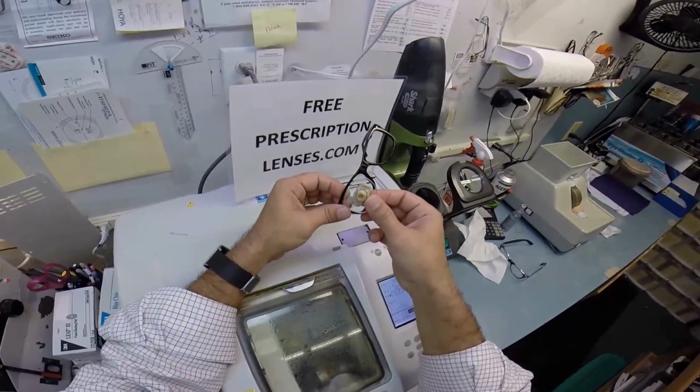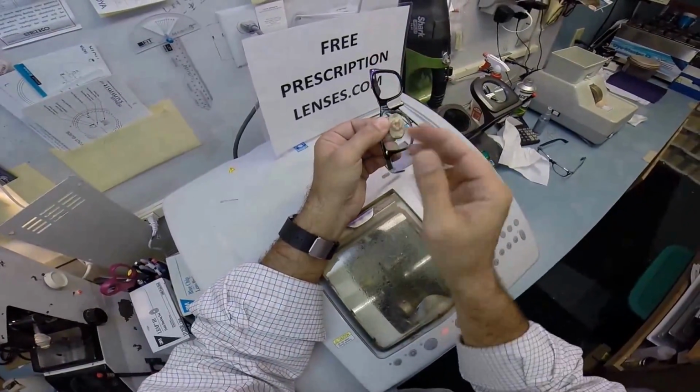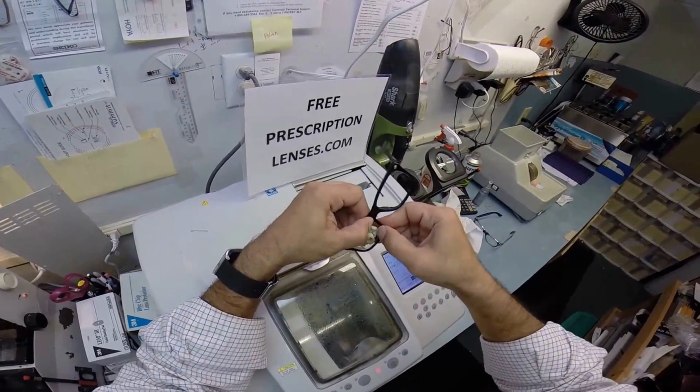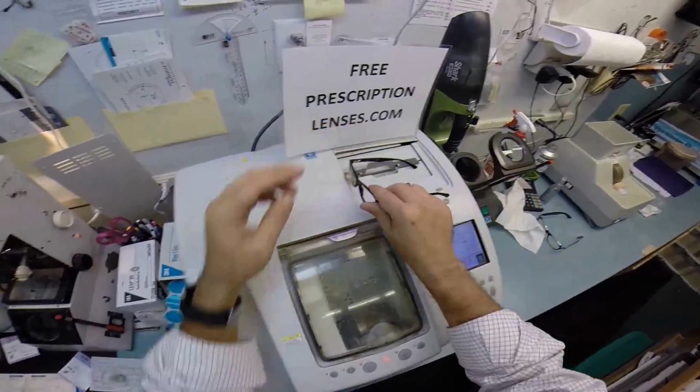So I tuck them in at the outside corner first, and again I have the frame perpendicular to my body and the side that I'm working on closest to me, but I tuck it in at the outside corner first, and then I press down with my thumbs at the nose and it snaps right in.